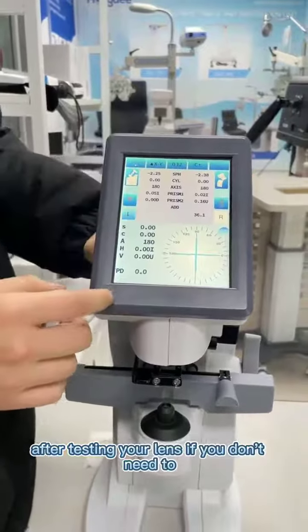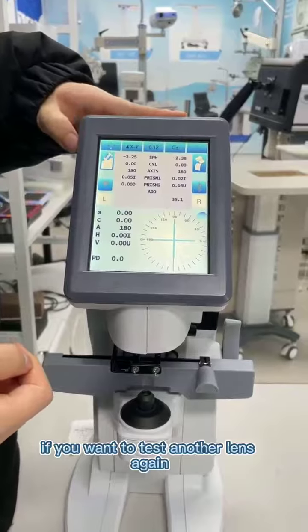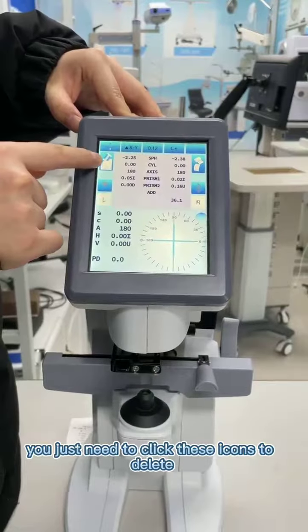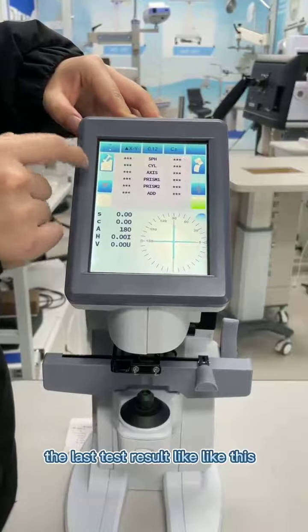After testing your lens, if you want to test another lens again, you just need to click this icon to delete the last test result, like this.